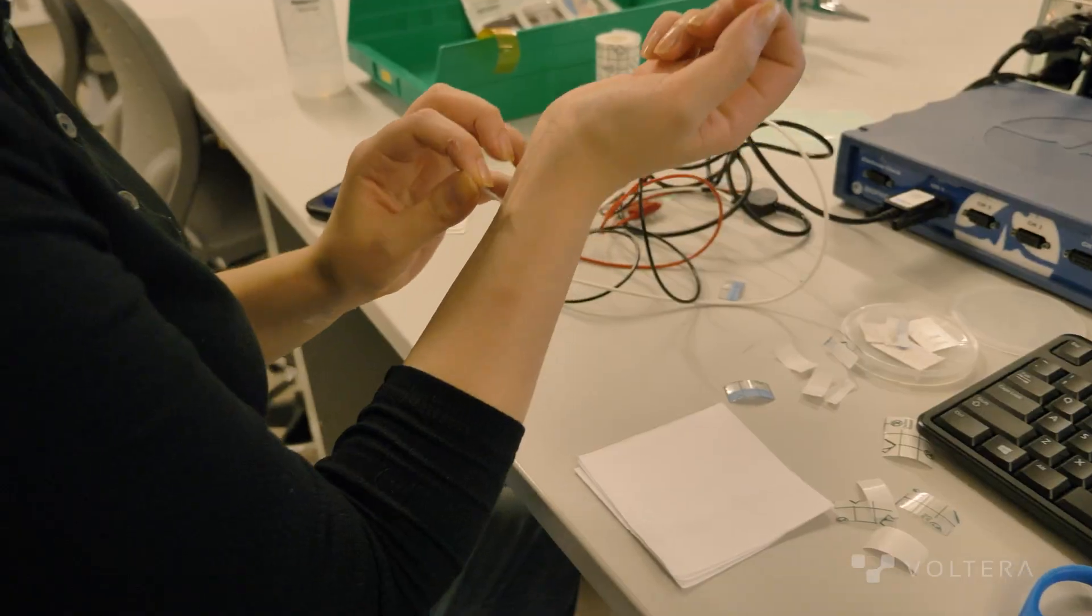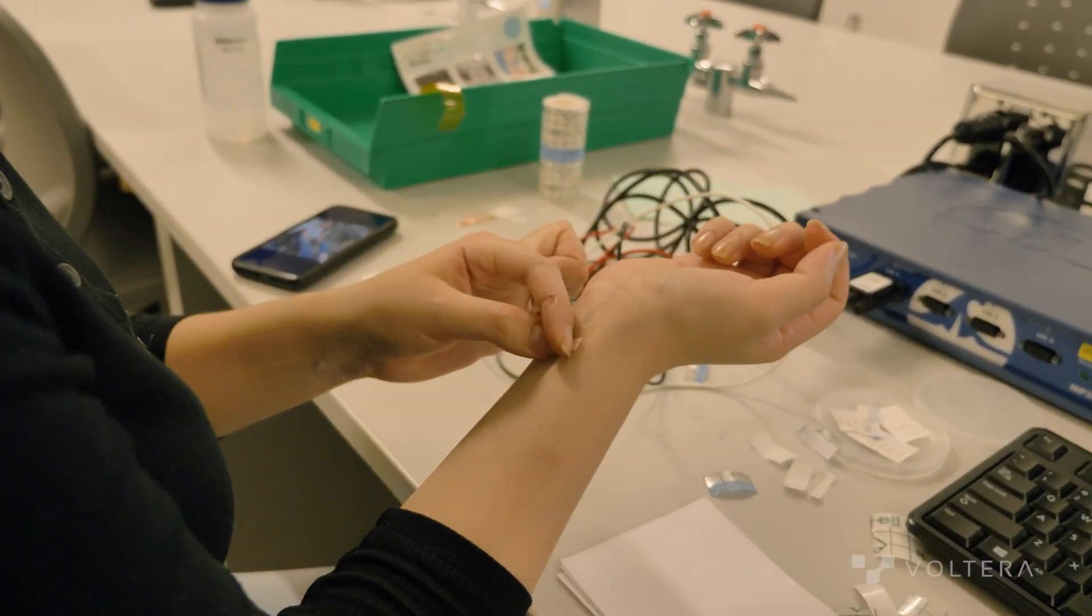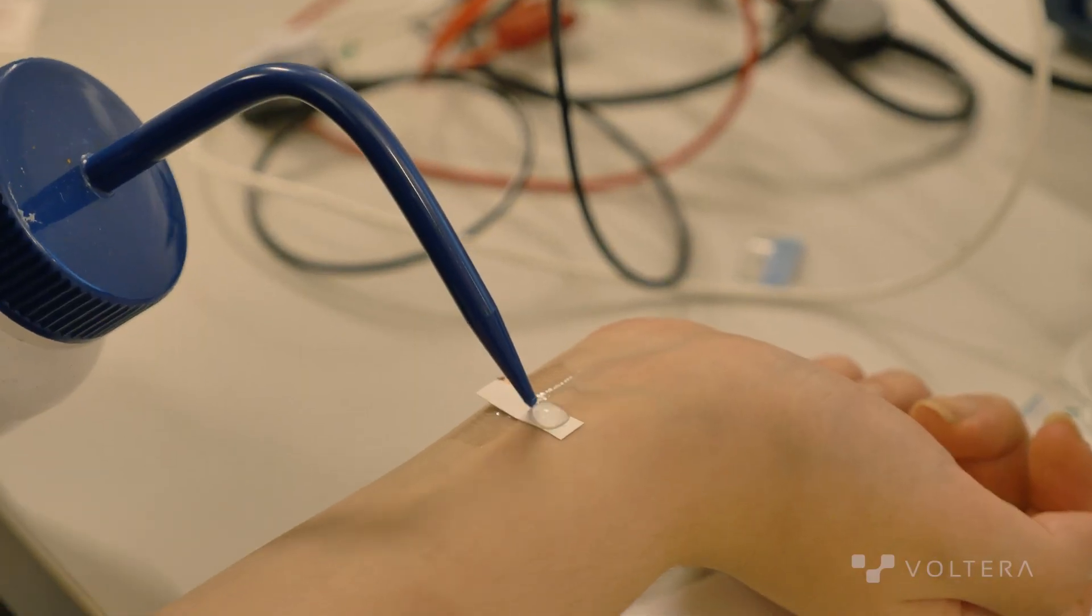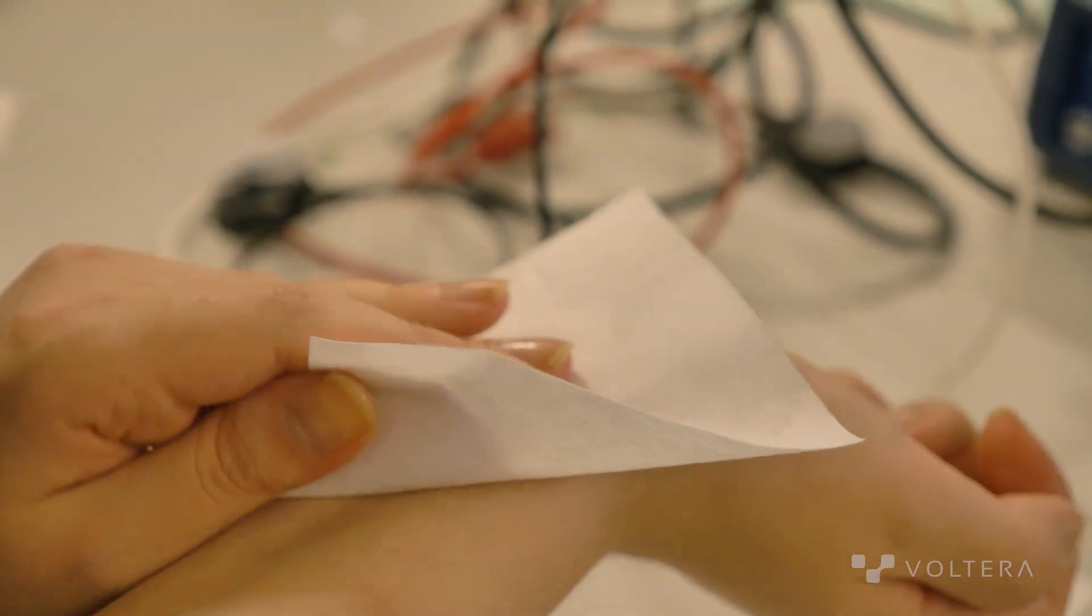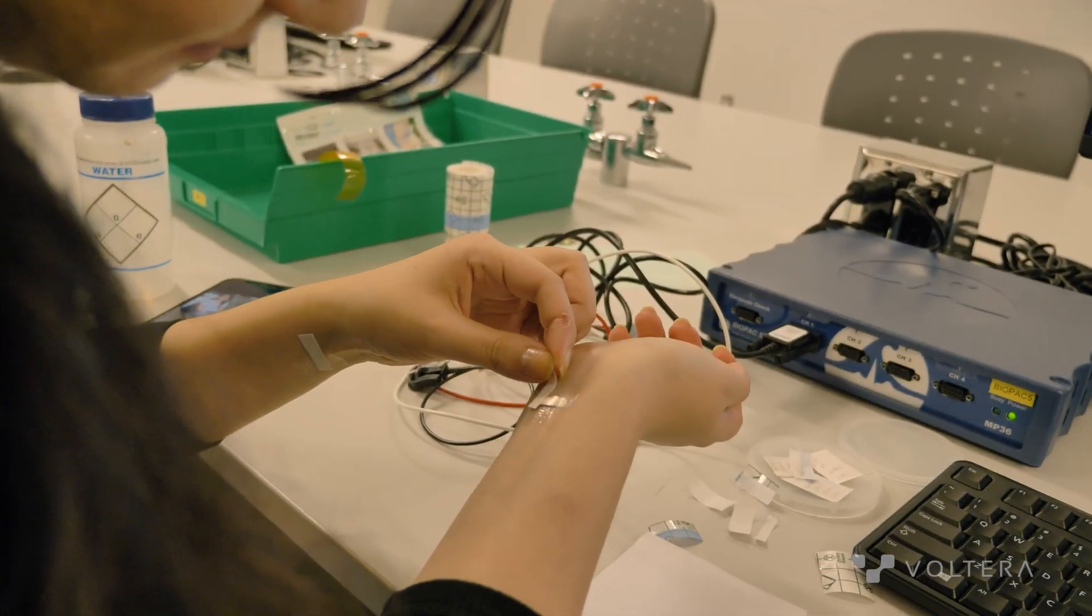The tattoo paper itself has a layer of starch on top, and this allows for a pattern to be printed and then transferred onto the resulting surface, which is the skin.